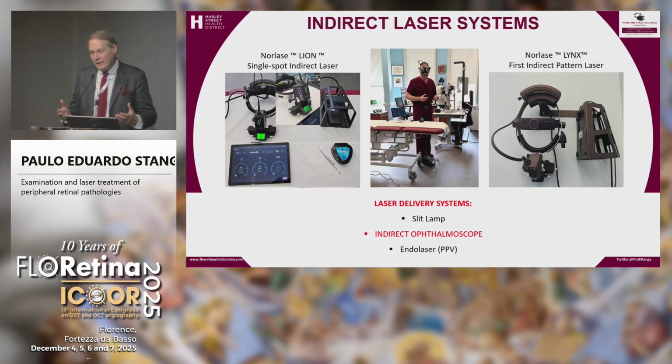Like Pascal, you may remember my presentations. I did a lot of research in Pascal and laser, and now I've moved to Lynx, so you can do 2x2s, 5x5 patterns with the same Lynx. You can also do single spot. And this is what the scope looks like on my head, of course.